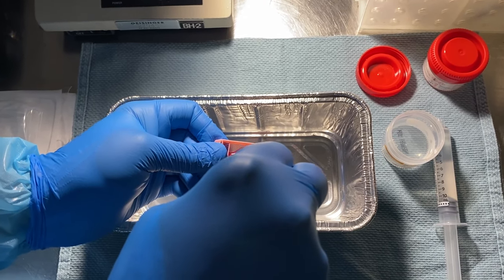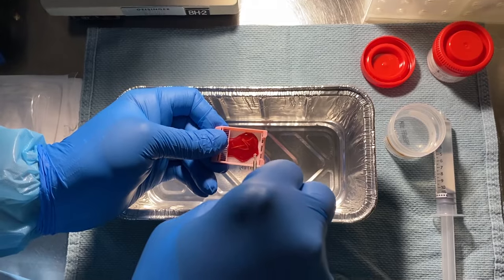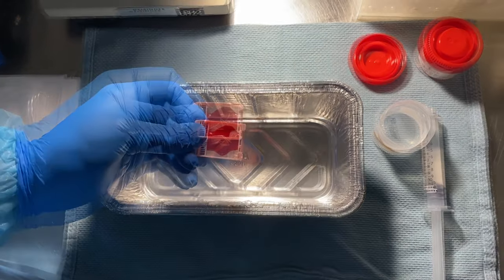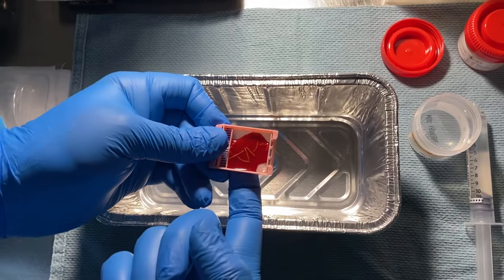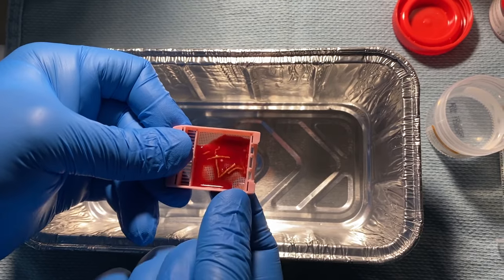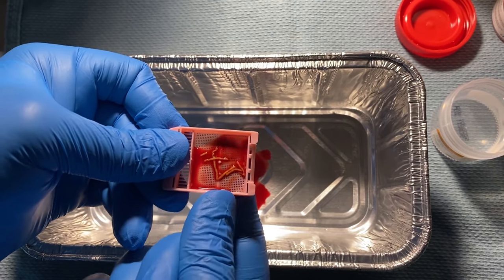At this point the liver specimens are floating within the expressed solution. The specimen is then cleansed.